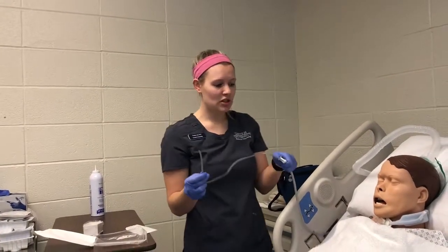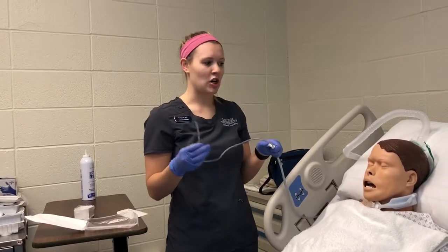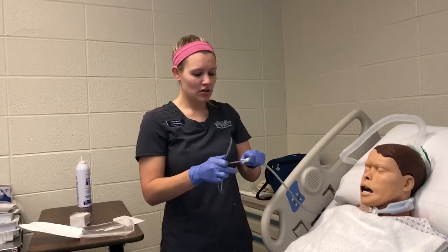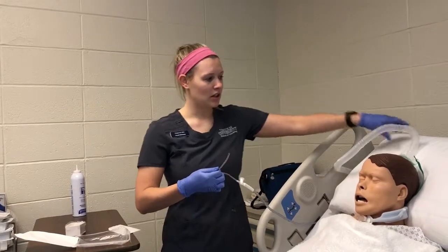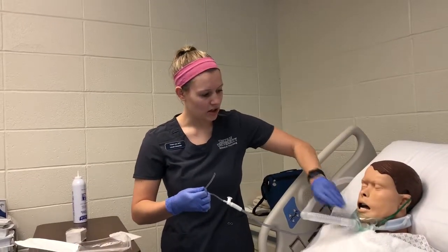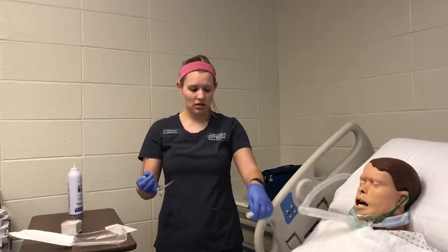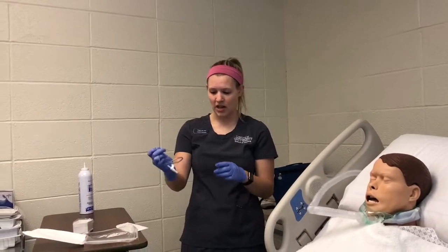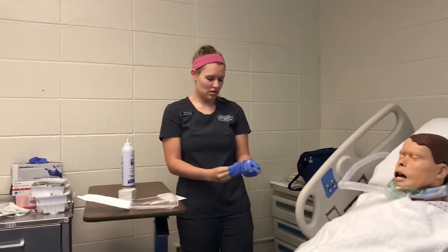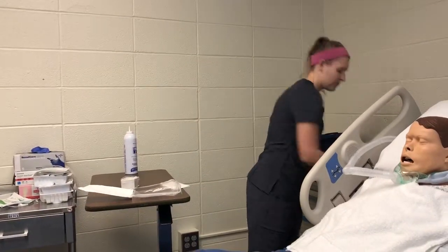So my patient is good to go with the suctioning, doesn't need any more. You can assess lung sounds and make sure they sound clear. So then this is my non-sterile hand, put the oxygen back over my patient's trach so that they're still getting some oxygen, and then we're done with the suctioning. So I can undo this and put this in my hand. Do that and toss it in the trash can.